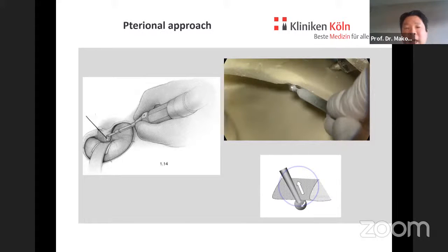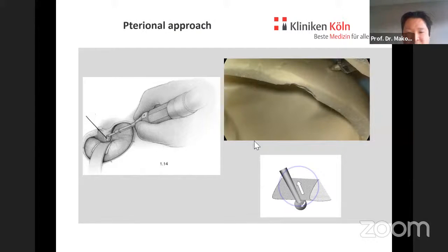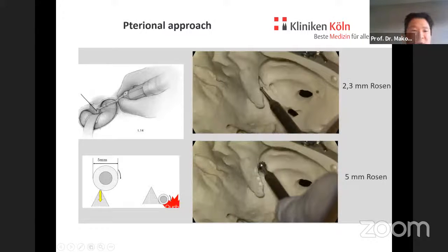And in every situation, of course, you need to rest your hand at the edge of the craniotomy. And of course, you never do high speed drilling just freehand where you don't have any resting of your hand. That is too difficult and too dangerous.